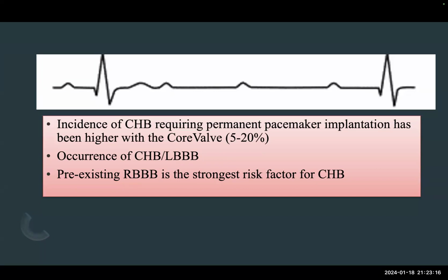It's not free of risk. So do a pacemaker only if there is a new left bundle branch block. Number two, which I usually do, is to observe with prolonged monitoring. And number three, which can be done and is easy to do, but we don't do it because it's not cost effective in my hospital, is to do an EP study.